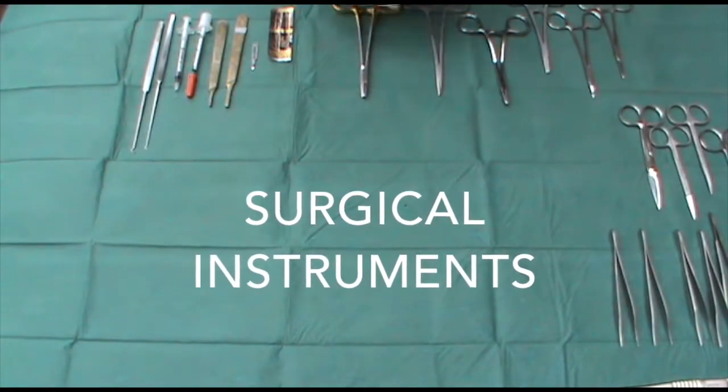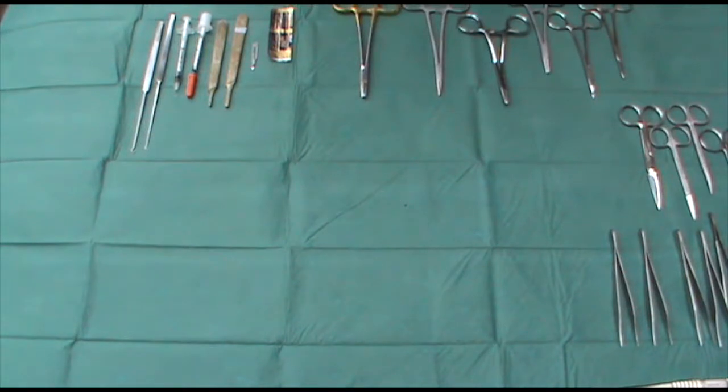When discussing surgical instruments, I have a variety of them laid out here, and I'm going to talk through the various different instruments you may come across.